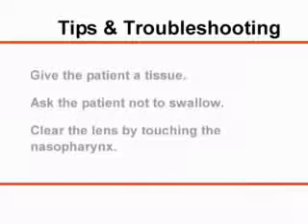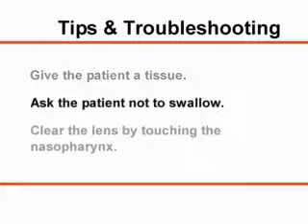Here are some tips that will facilitate successful laryngoscopy. Give the patient a tissue prior to starting the procedure. Nasal instrumentation may elicit a tearing reflex or sneeze. Ask the patient not to swallow throughout the exam.